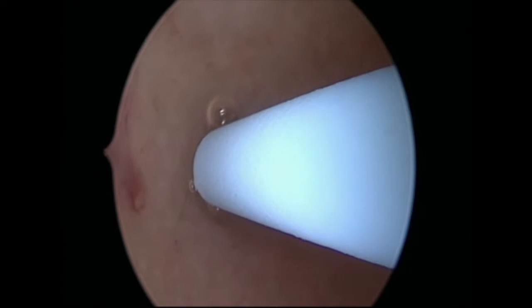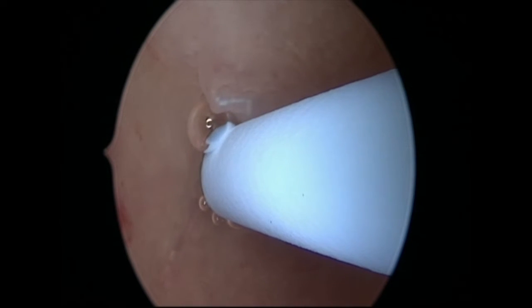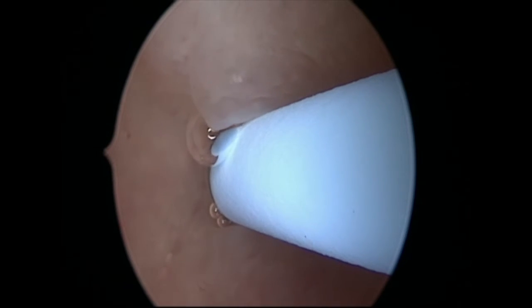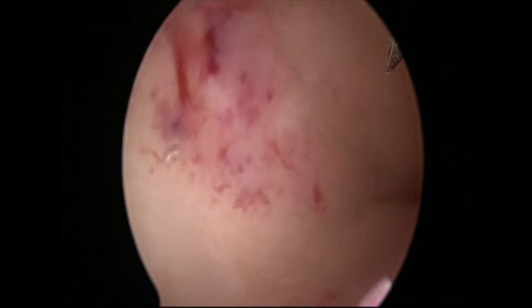This is a video of a fundal block for an outpatient endometrial ablation. We use a 5 French channel, a Cooks-Williams needle, and a Storz-Potacci scope. We use Chirocane 2.5 mg per ml and I'll use around 6 ml of this in a Luer-Lock syringe.